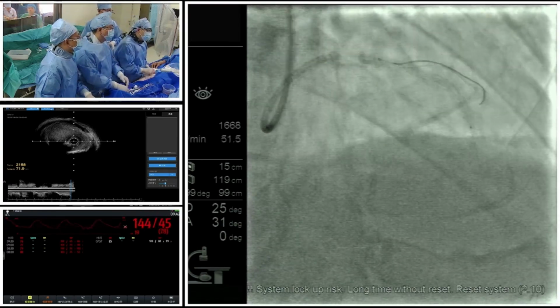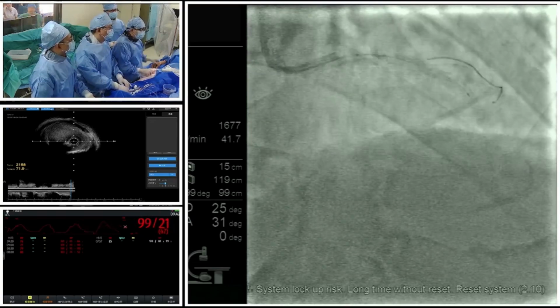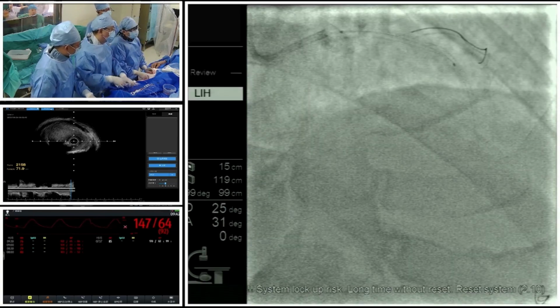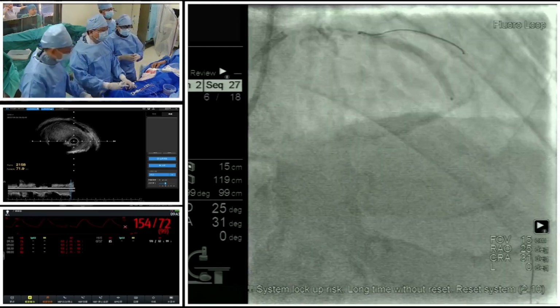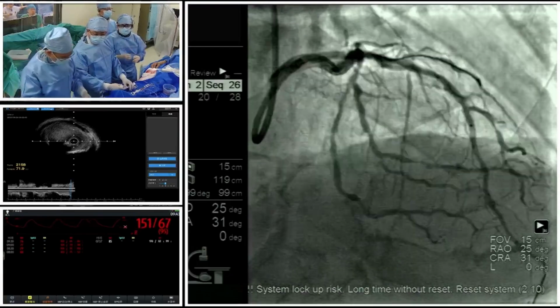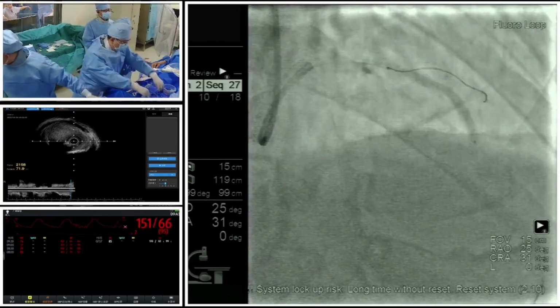Okay, because for this patient, the stenosis is very severe, and firstly, the IVUS catheter cannot be delivered, and I think the IVL balloon also could not cross the lesion, so we performed rota firstly to dilate the lumen, in order to get easy delivery of the IVL balloon and cross the significant stenosis portion of the lesion.